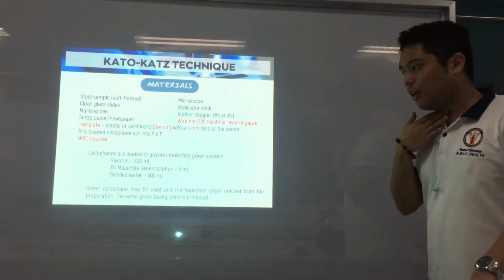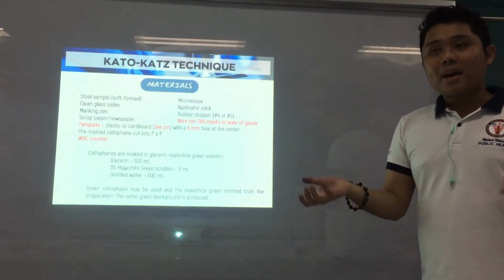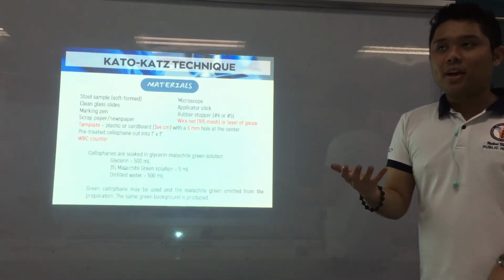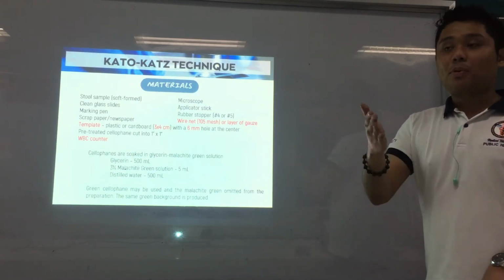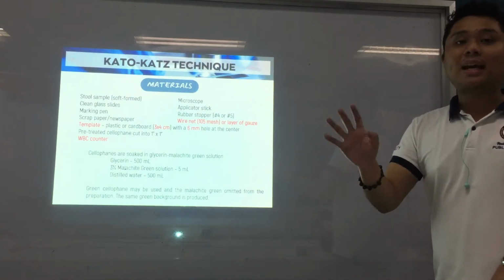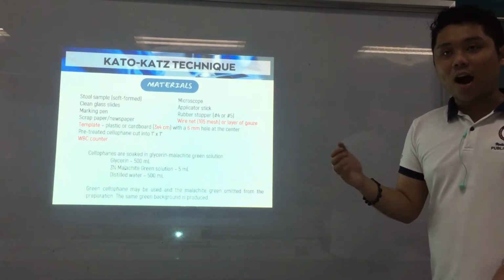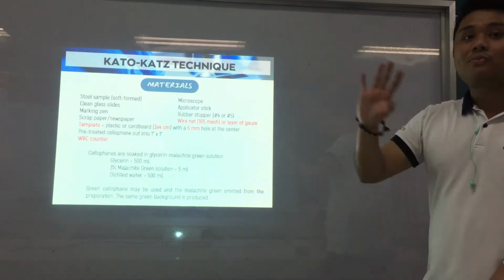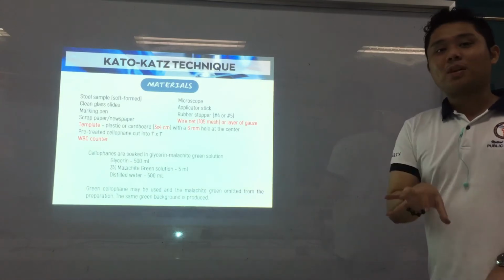The WBC counter is a type of counter, but it's much bigger. We use that for WBC count, when we find the number of neutrophils, lymphocytes, monocytes per peripheral smear. So we can also use the WBC counter for the purpose of counting parasites this time. But you can also use a tally counter. But I think there are limitations on how much a tally counter can count, because some of our samples in Kato-Katz can reach 50,000, 10,000 eggs, depending on the intensity of the infection. Again, that's the main purpose of your Kato-Katz.